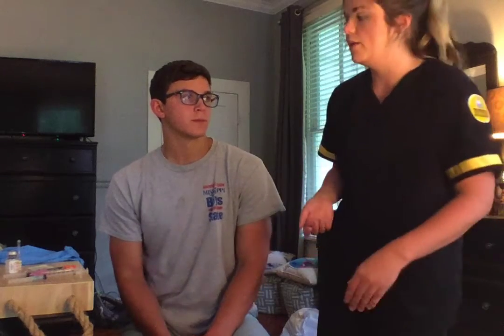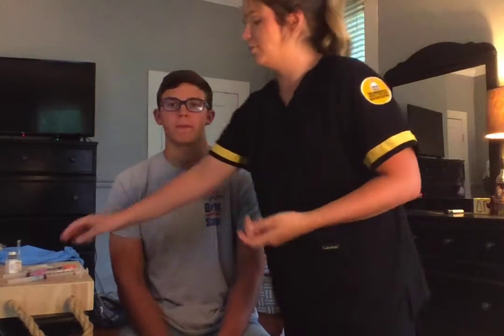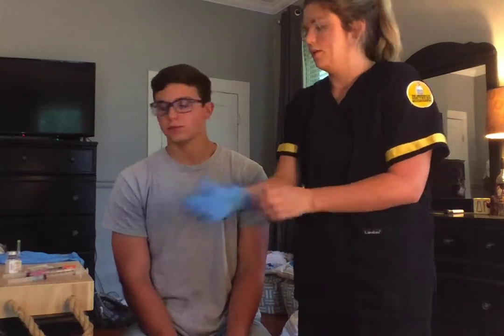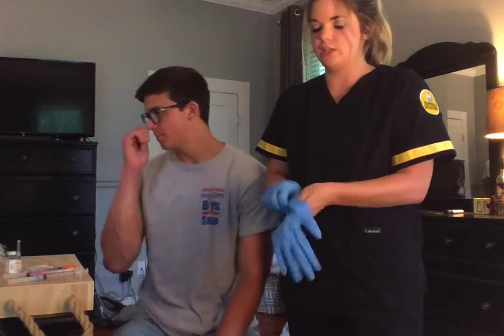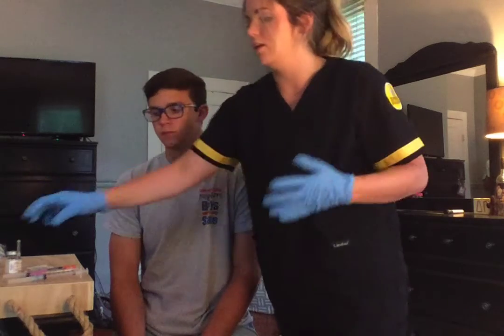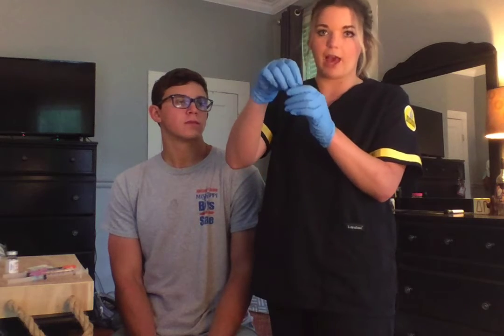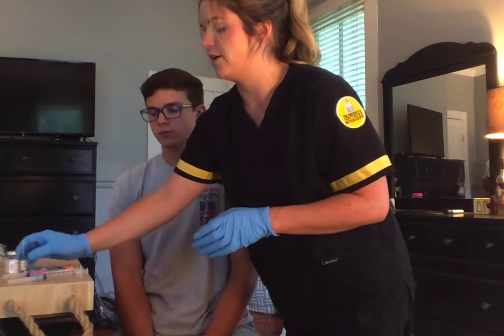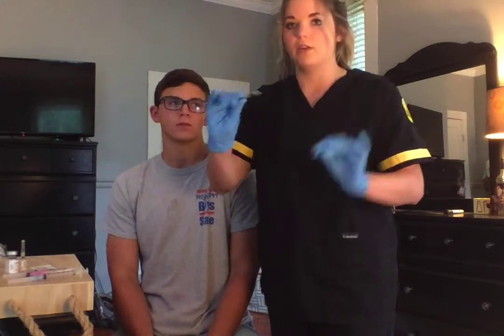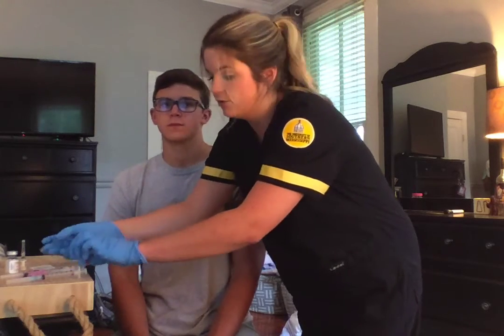So now we can get started. I'm going to start by washing my hands, and then I'm going to put my gloves on. The first one that we're going to give you is your insulin, and I'm going to be using an ampule to give you your insulin. It is a single-use vial, so after I use it, it can't be used again. I'm going to take my ampule and make sure all of the liquid is out from the top. I will break my ampule, set it back down. I will take the insulin syringe, since we are administering insulin, and I will take the cap off. I will put it into the ampule and pull back to the 10 units of insulin that we need, and I'm going to carefully put the cap back on it.